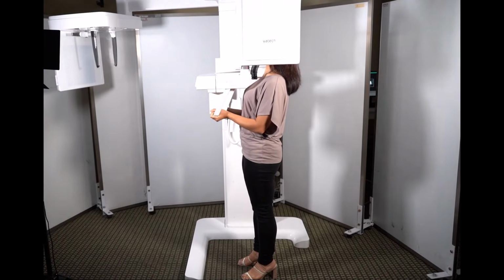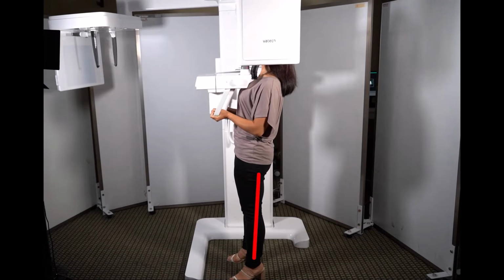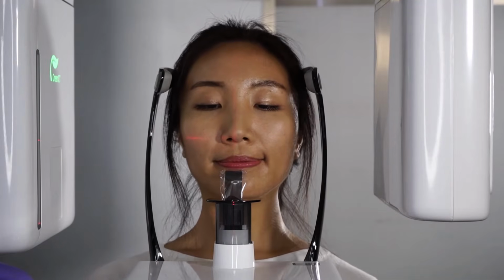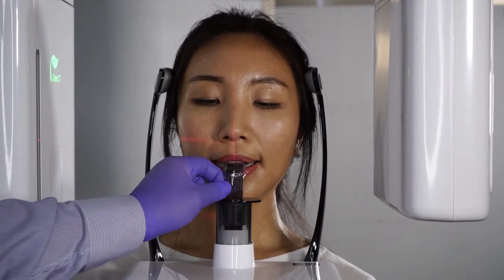Ideally, we want the patient's spine as straight as possible and chest close to the device, so we'll have our patient take a step forward and notice the angle of the body. Next, have patient bite in the bite stick, ensuring they're biting in the grooves and secure in place. Push down on the bite stick to ensure the patient's chin is firmly on the chin rest.